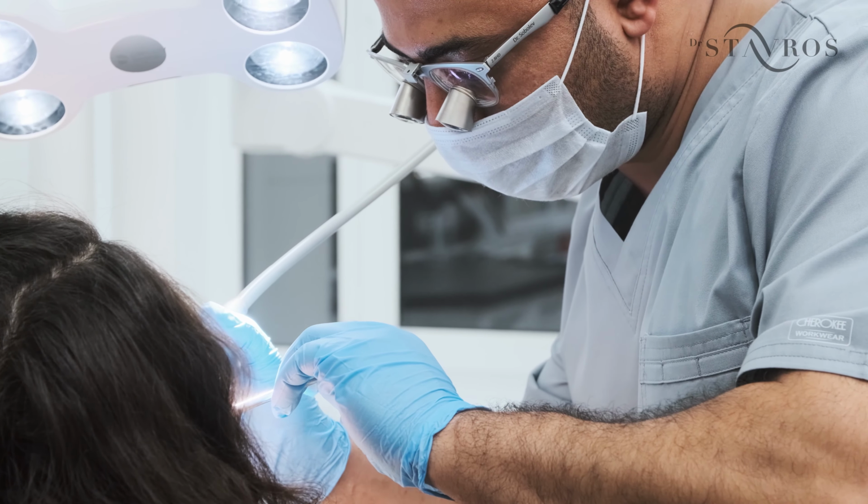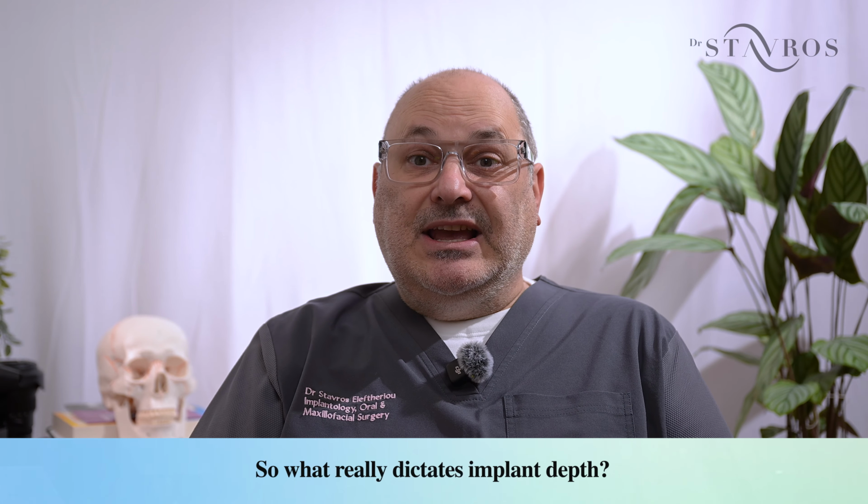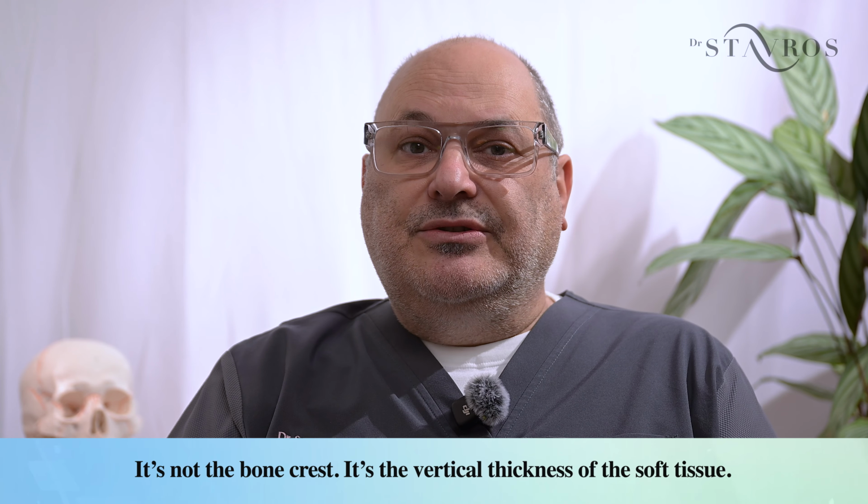Every implant you place triggers a biologic negotiation. Place it too shallow and the bone will remodel. Place it too deep and you risk inflammation, deep sulci and aesthetic collapse. So what really dictates implant depth? It's not the bone crest, it's the soft tissue thickness.